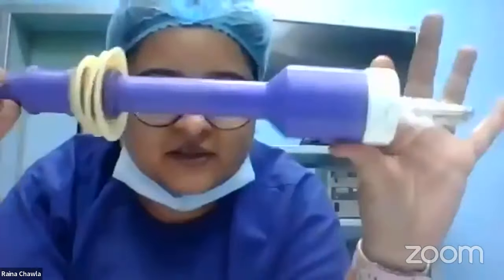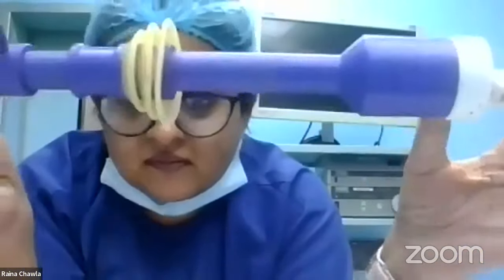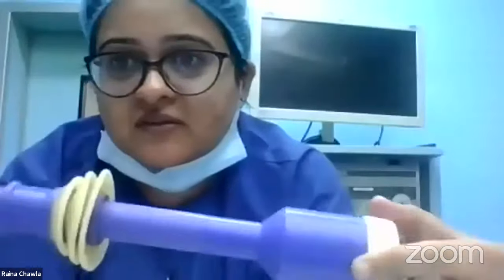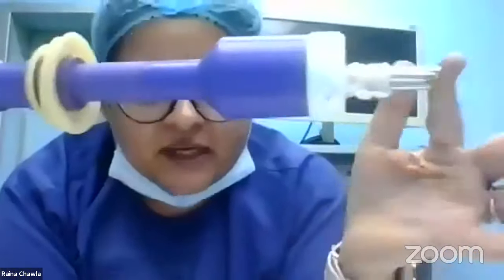Okay, very important. One instrument I completely left out, for the postgraduates, also the undergraduates, but more importantly postgraduates. What is this? Can anyone tell me what this huge instrument is? Tanvi, where's Tanvi? I know she's a postgraduate student. Okay, so this is a uterine manipulator.